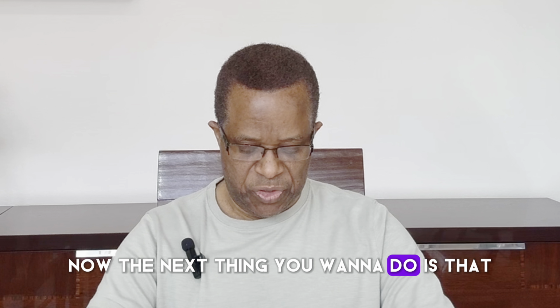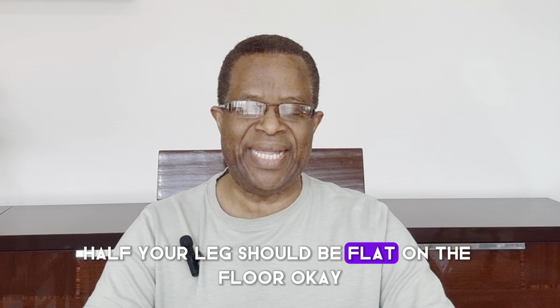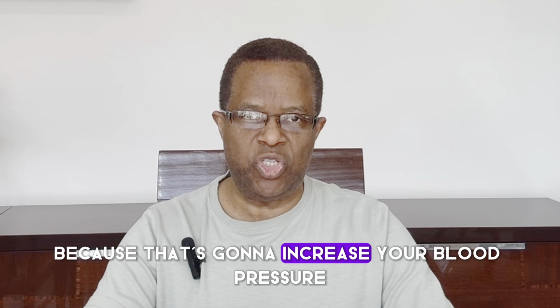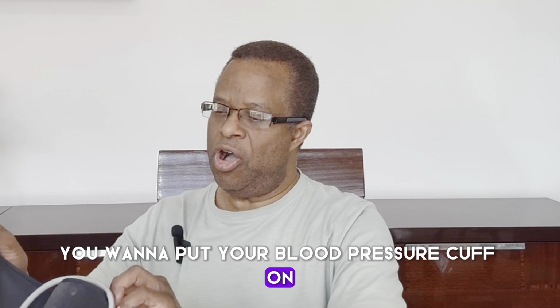Now, the next thing you want to do is that you do not want to cross your legs. Your foot should be flat on the floor, okay? No crossing of legs, because that's going to increase your blood pressure. And the next thing you want to do is put your blood pressure cuff on.